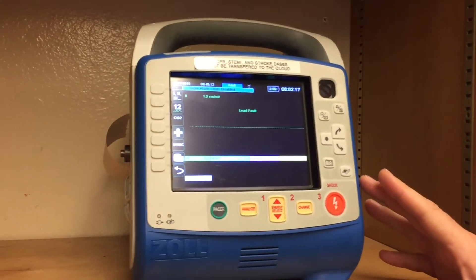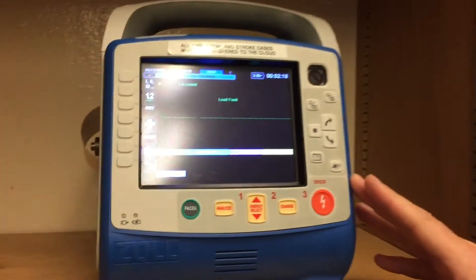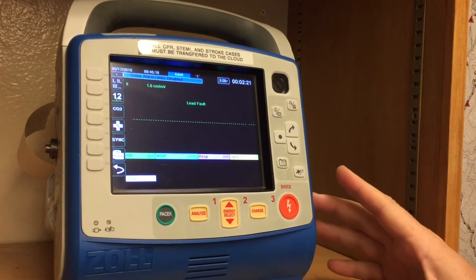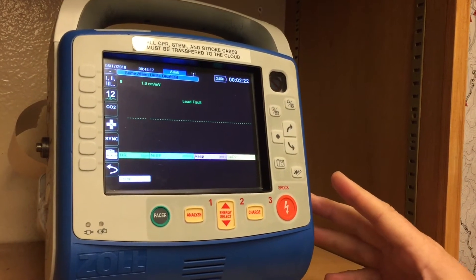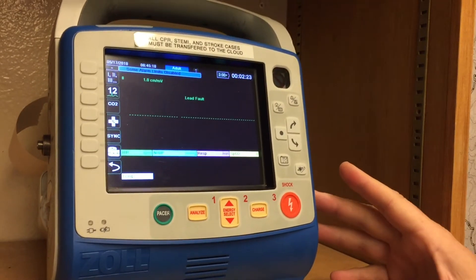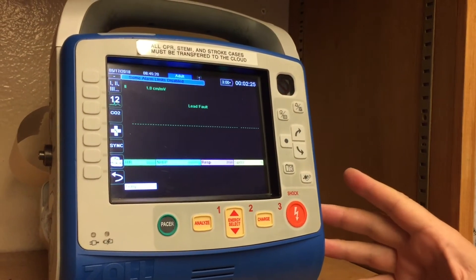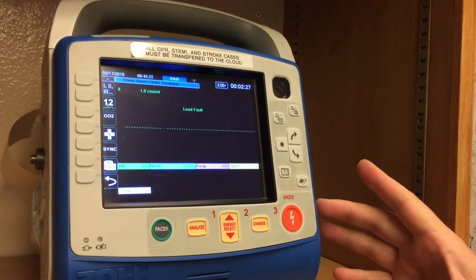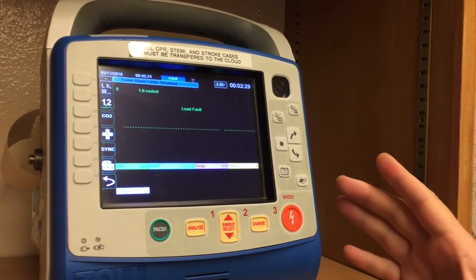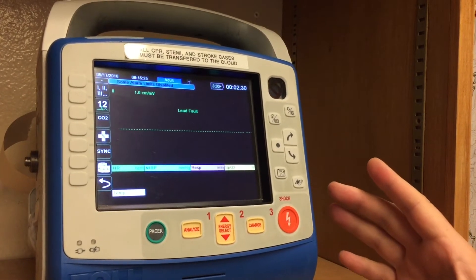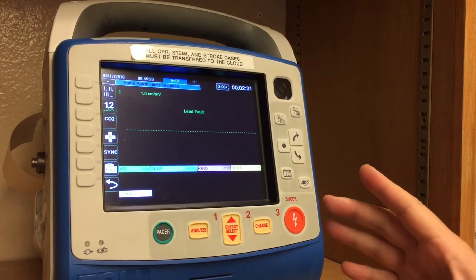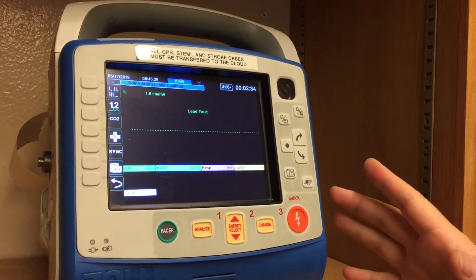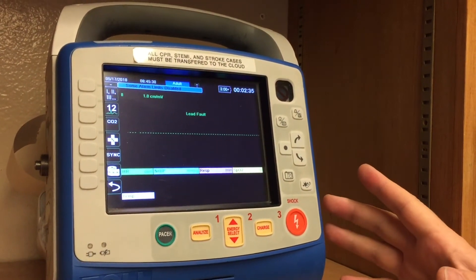On the Zoll X-Series monitors, sometimes when you take a 12-lead you will notice that the distribution list is not populated — for an unknown reason it will actually just be removed. It's a really simple process to make sure that you get those hospitals back in there.